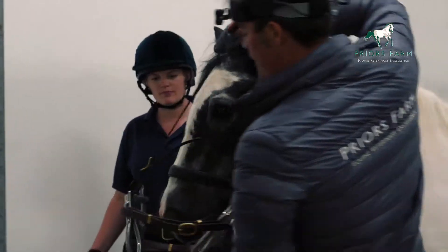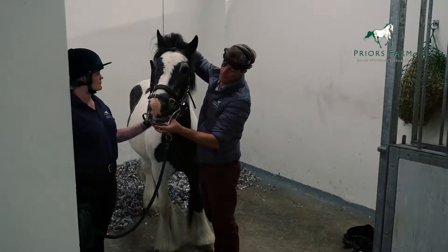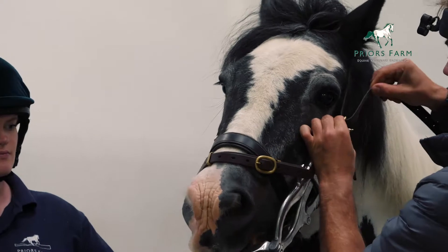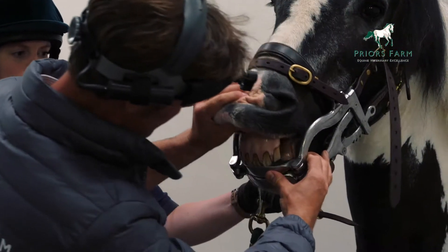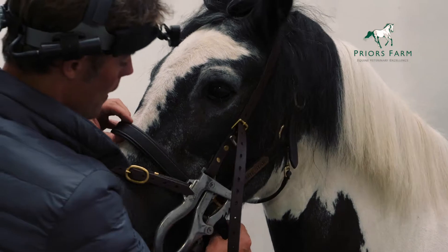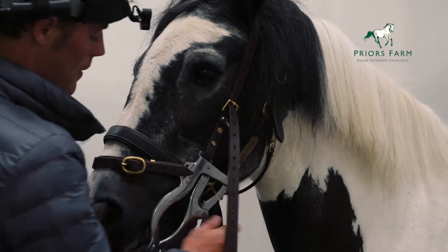Then we need to have a look inside the mouth. Check that the gag is fitting correctly and that you've got plenty of room with the head collar. If the head collar is tight, then you might actually need to remove the head collar to have a look. But in this case, there's plenty of room.